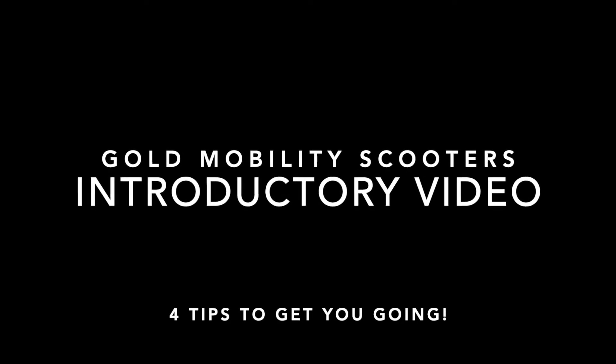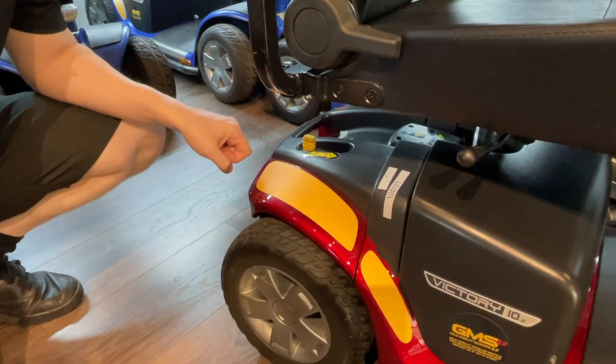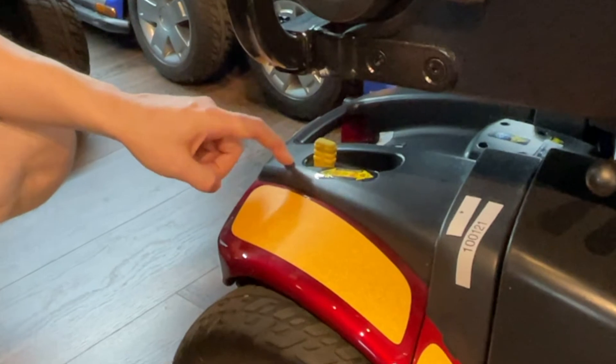Welcome to your Gold Mobility Scooter introductory video. To get started, first make sure the yellow lever behind the seat faces the back of the scooter.